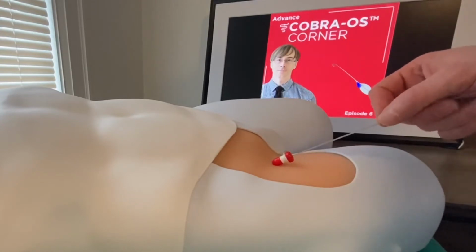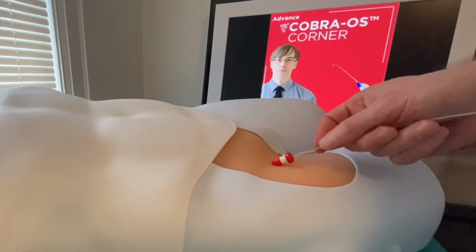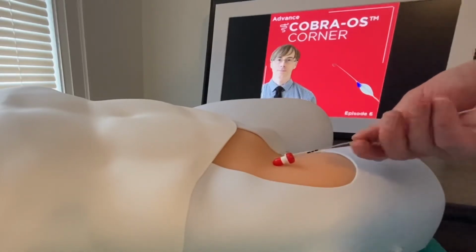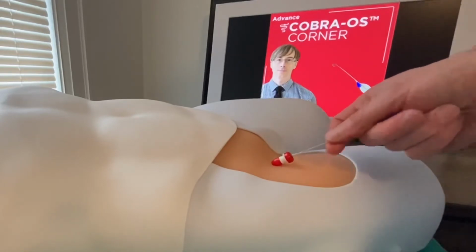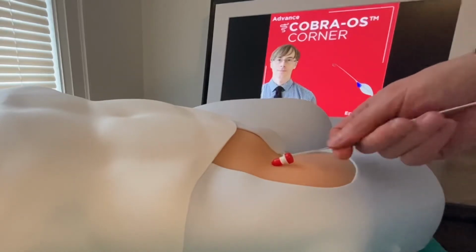When advancing the COBRA-OS, the JTip prevents aortic branch entry. However, if you do encounter resistance, pull the device back, twist it, and re-advance. This might help the JTip navigate the patient's anatomy.